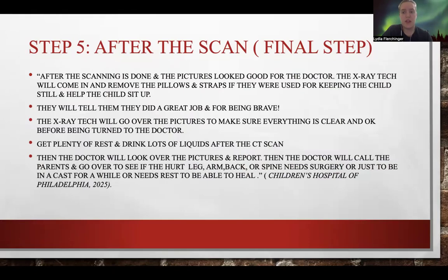Then, once everything is done, the X-ray techs will talk to your mommy and daddy about how everything is looking, and then they'll send those pictures to the doctor. The doctors will call your mommy and daddy and say, okay, we looked at the pictures. Everything is looking good. We don't see any bone fractures. We don't see anything wrong with your brain or your head or your spine or your leg or arm or anything else. We don't see any bad stuff near your stomach or anything.